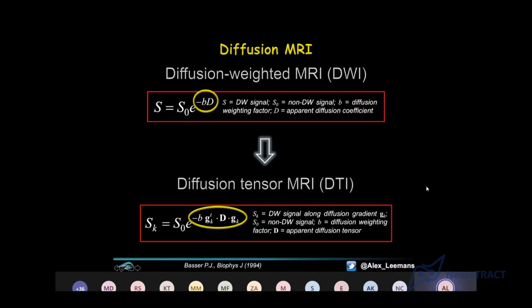So they came up with a framework, with a model, the diffusion tensor, as shown in the bottom, that could basically capture the covariance of your diffusion in such a way that no matter how you were oriented in the scanner, the actual diffusion coefficients that you would compute from this framework would be the same. And this was a major breakthrough.